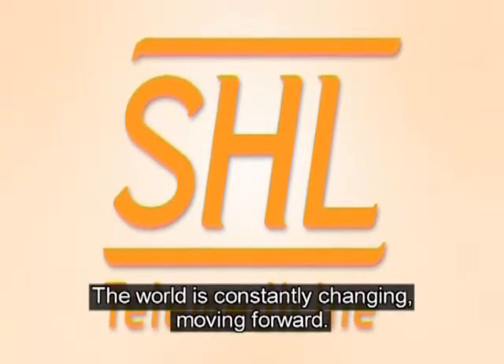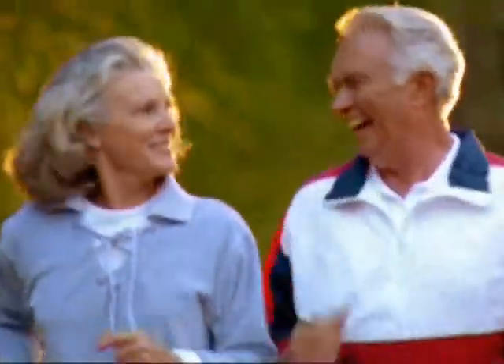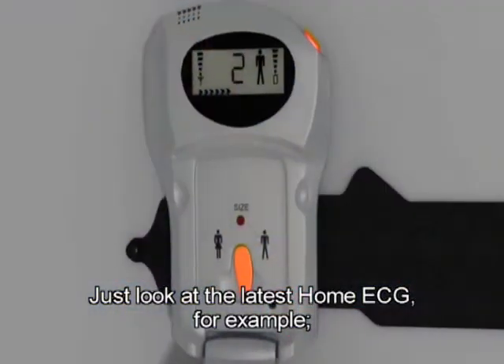The world is constantly changing, moving forward. The medicine of the future is at your doorstep. Just look at the latest home ECG, for example.